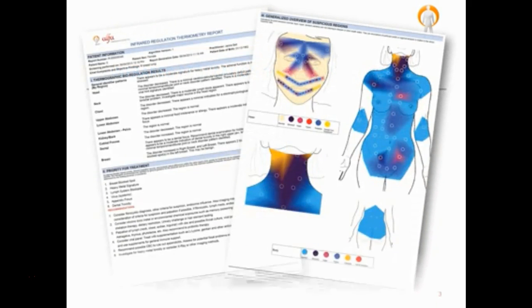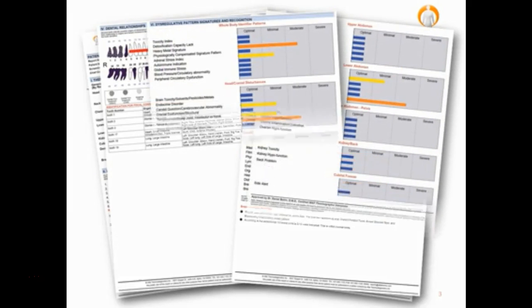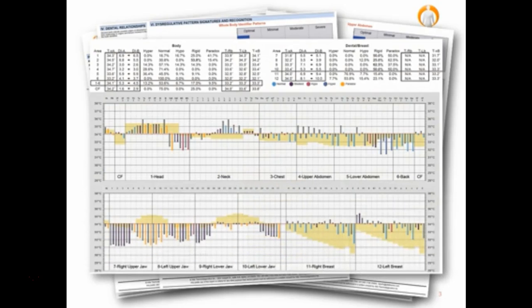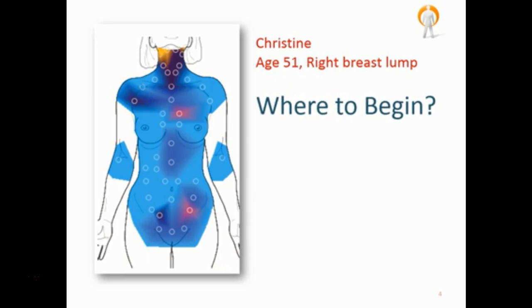There are several pages to the AlphaView report, and through your trainings you'll discover that every section carries insightful information, very often key information that'll help you decide on the best treatment strategy for your patient. So that when a patient comes in with presenting symptoms or a diagnosis, you'll know how and when to address the priorities and direct further diagnostic testing.